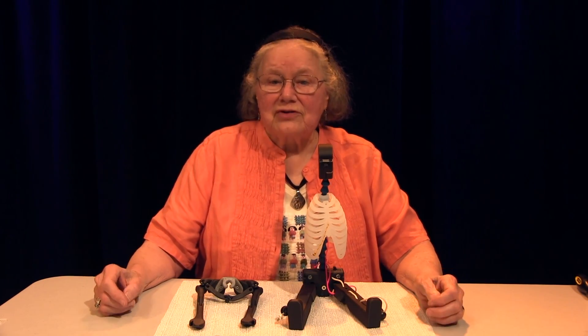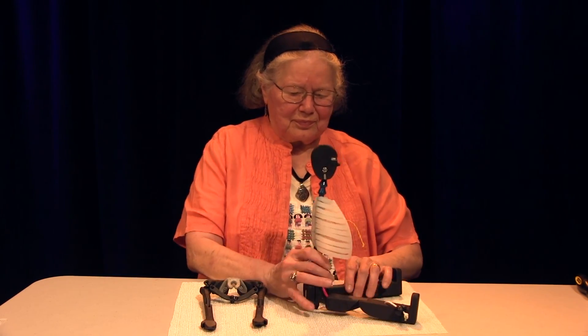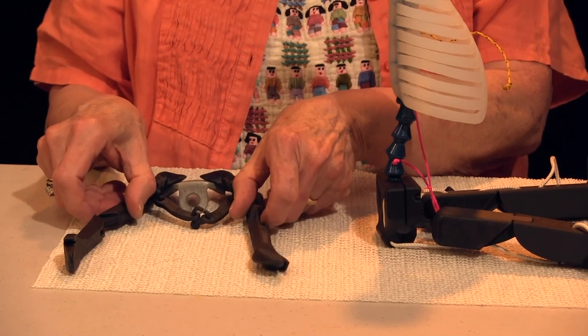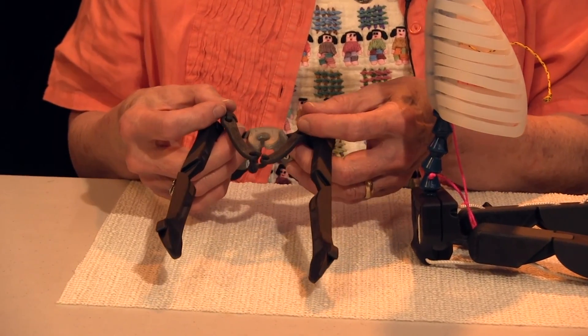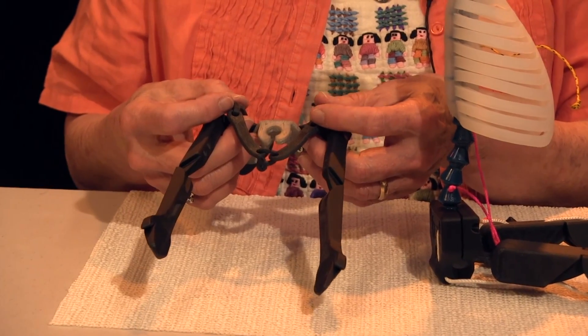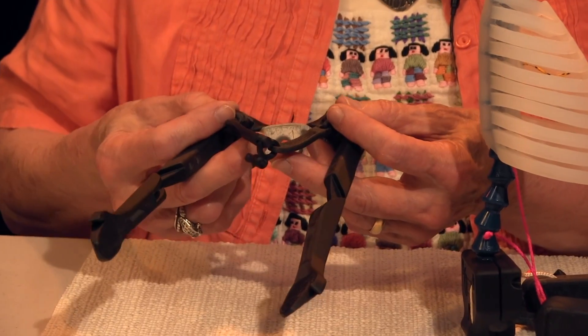I will now show you how to install and remove the shoulder girdle. Turn HAMI sideways. Enlarge the opening between the scapula and the clavicles by rotating the scapula upward, bringing the arms forward, while supporting the clavicles up and forward. This makes the opening large enough to fit over HAMI's head.